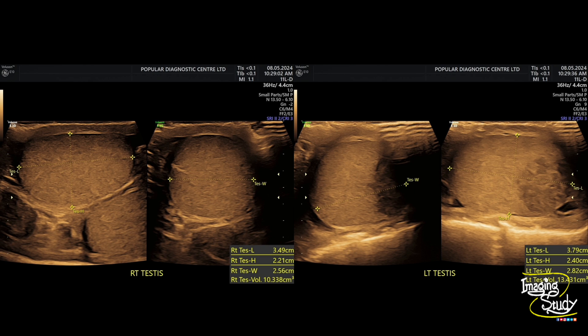Here you can see the measurements — both testes show normal measurements, but if you compare them with each other you can see the left testis is slightly bigger than the right one, which may not be of much significance here, but the left testis shows an inhomogeneous area at the lower part.